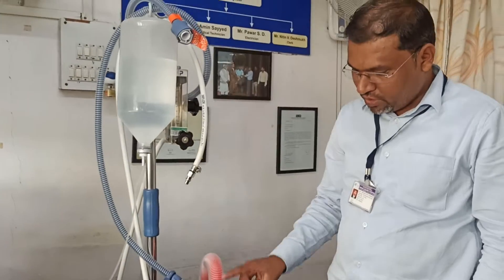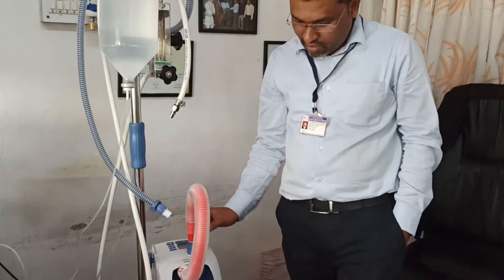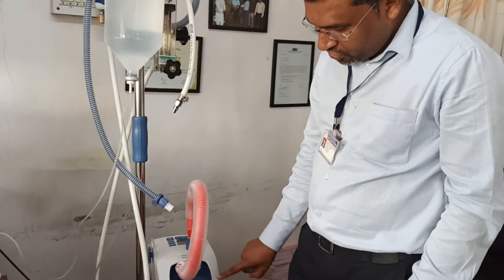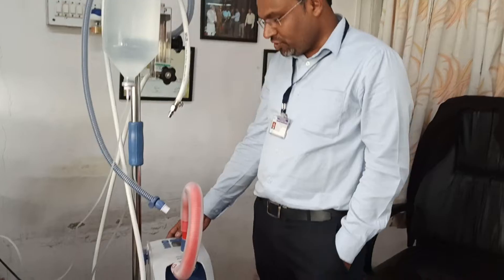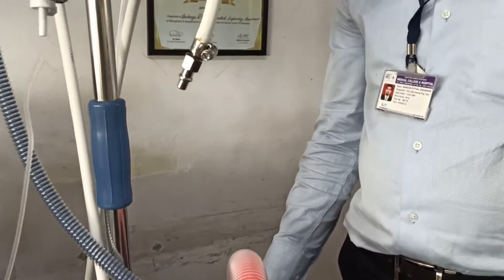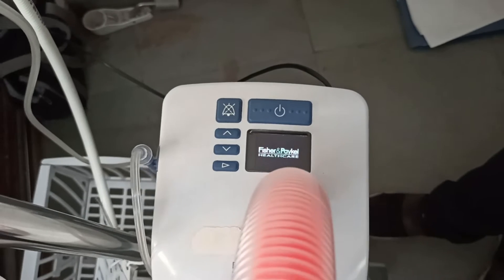To repeat: first you have to take the red color tubing — the main connection is here — and connect it at the left side of the machine. There is a blocker. This is the basic arrangement, and then you just switch on the machine. Automatically the machine will go into disinfection mode.